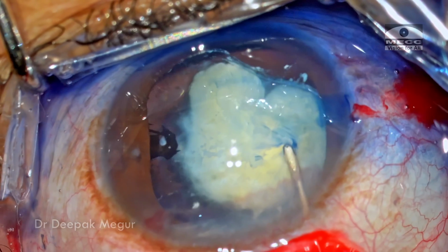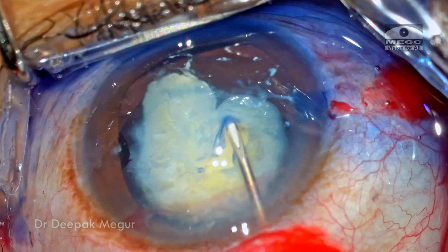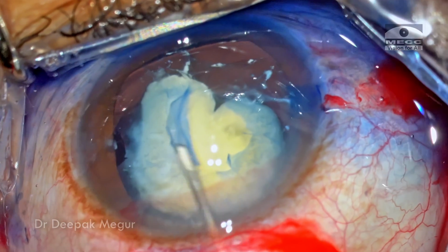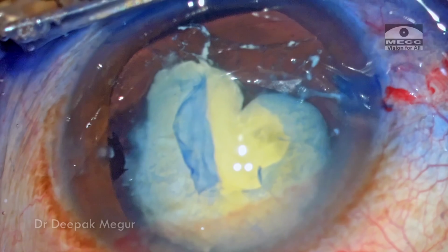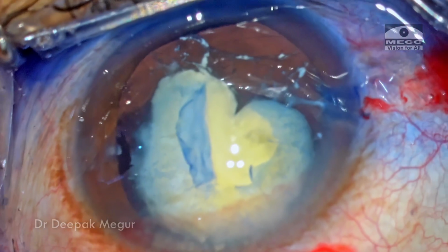Nevertheless, a small flap could be raised and the tearing can be initiated, and the tearing is continued in a circular manner until I reach this roadblock. Now this is an area where the capsule is extremely flimsy and there is no zonular support here. So it's refusing to tear ahead.